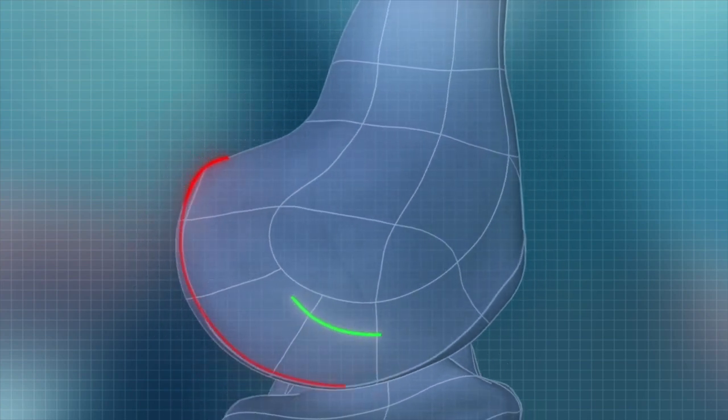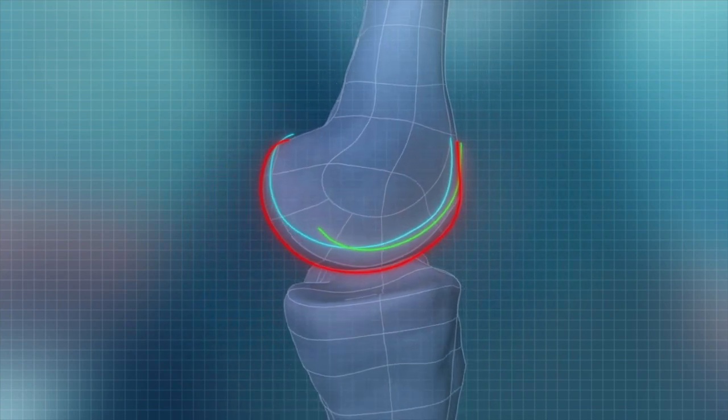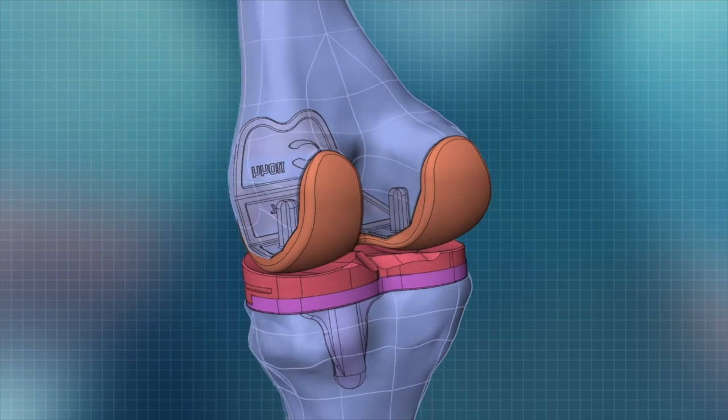The computer is also able to calculate the patient's J curves, which are these lines that show how the knee bends. These J curves are different for each patient and allow the knee to feel more natural as it moves.